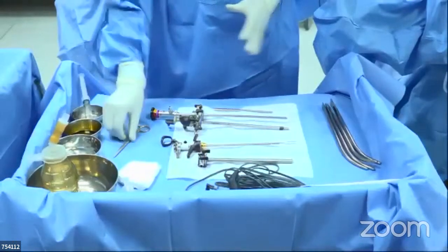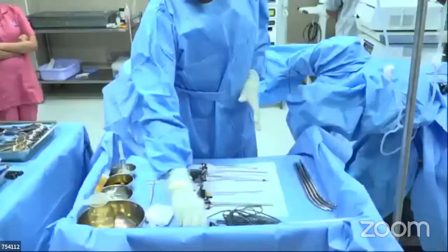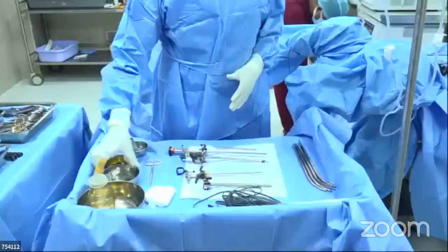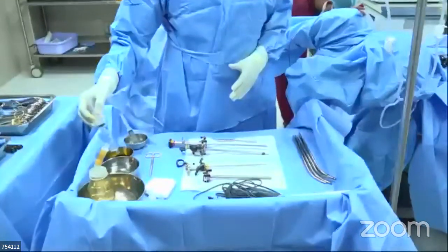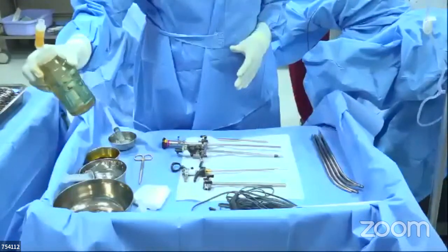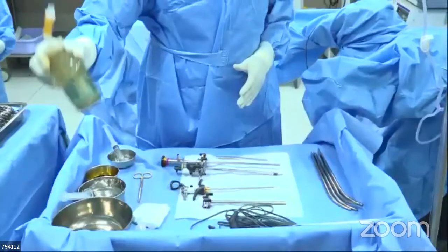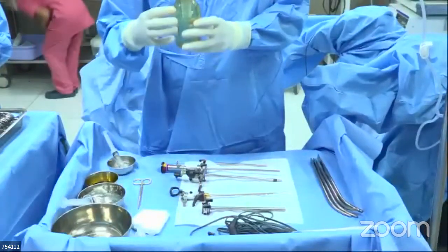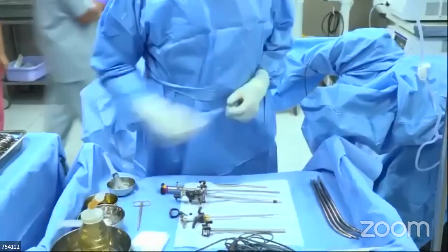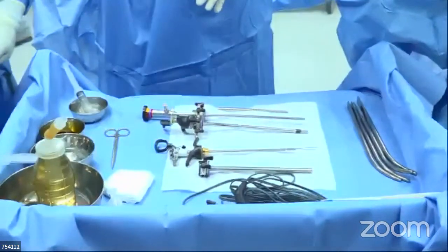And the rest of the things are scissors for a meatotomy and extra loops as necessary, and xylocaine jelly in plenty, and saline and a 20 cc syringe for inflating the bulb, and a Ellik evacuator of your choice. This is not actually the Ellik evacuator. It's a modification of the Ellik evacuator, which has become an absolute hit, wherein you just have a collection of the chips inside the evacuator after the resection. So this is the equipment we require. And anyway, this is an excess.